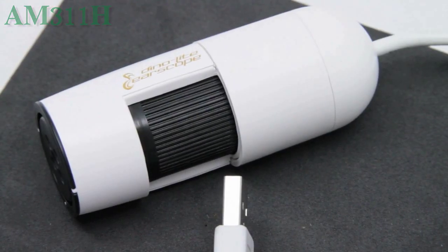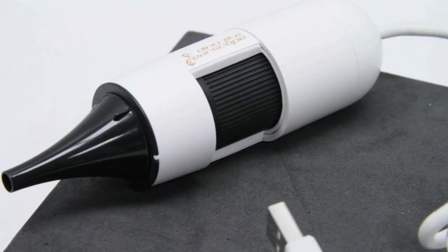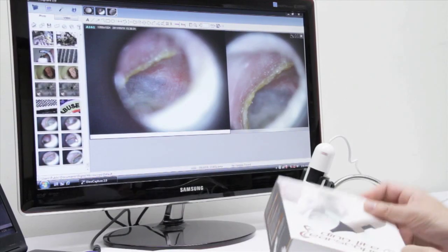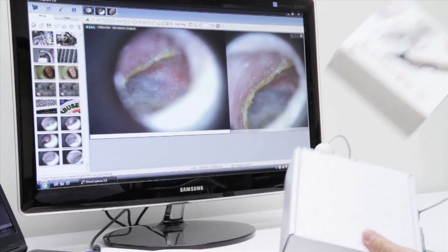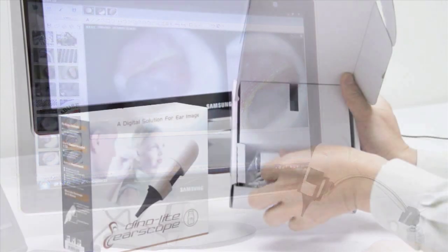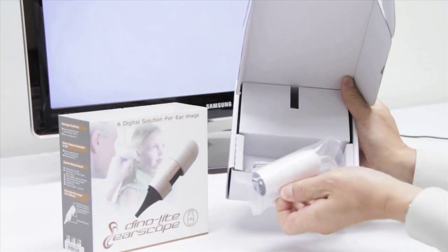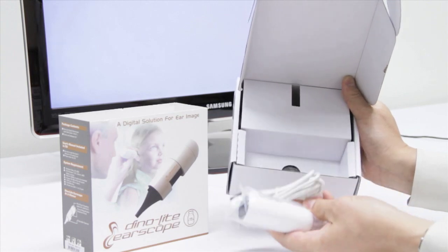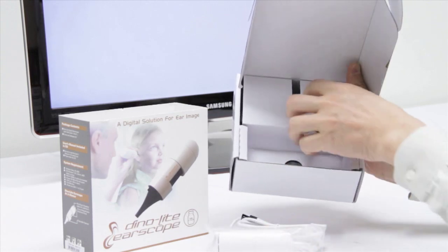Upon unboxing you will notice the scope, as well as a small carrying bag, and some replaceable front nozzles that will come complimentary.